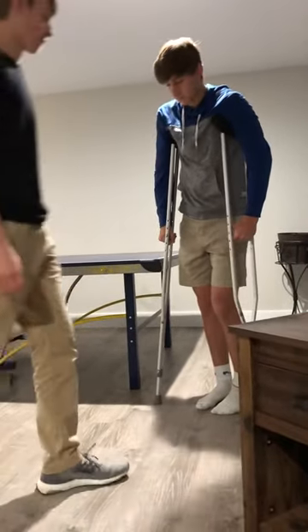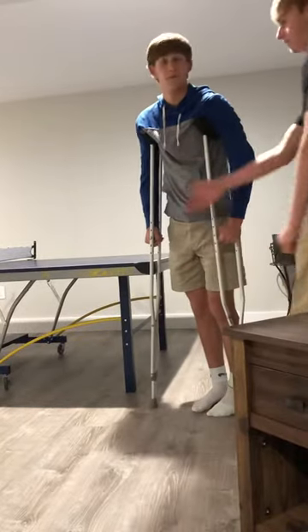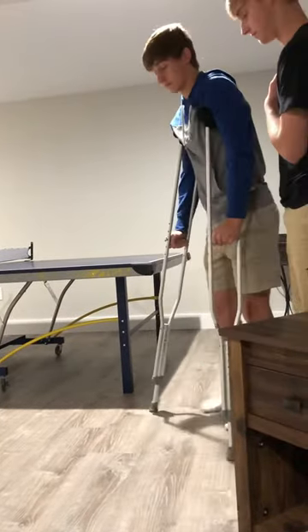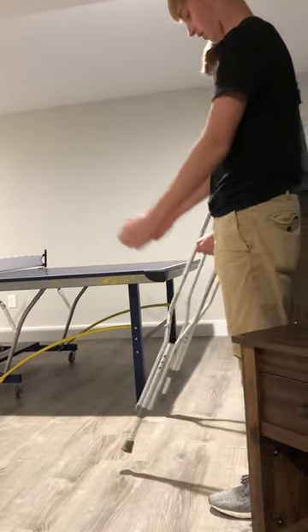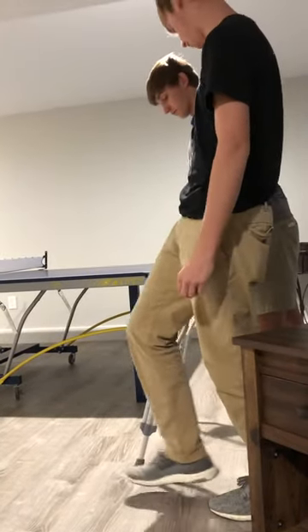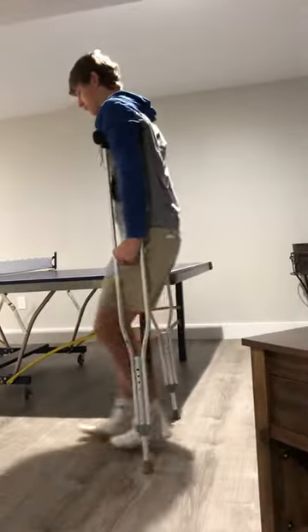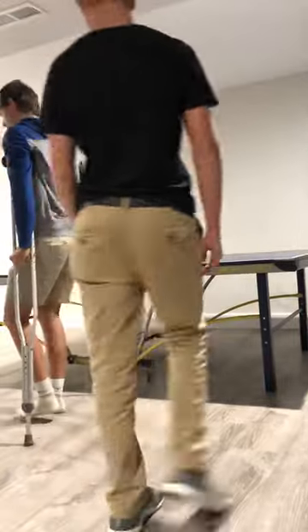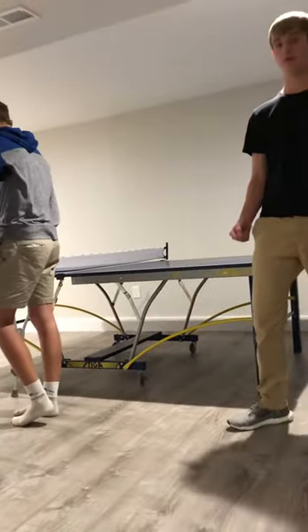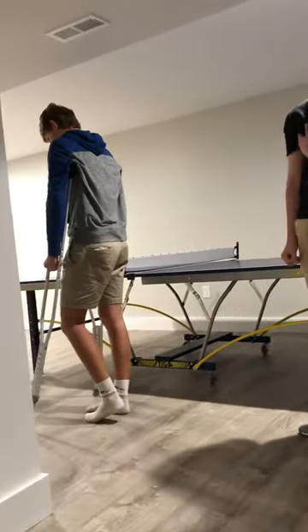And then, to walk in a straight line, you put the crutches out in front of you and then move with your bad foot forward. You wanna make sure that all the pressure is on your hand so that it doesn't hurt your armpits.